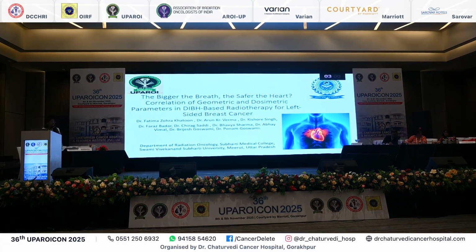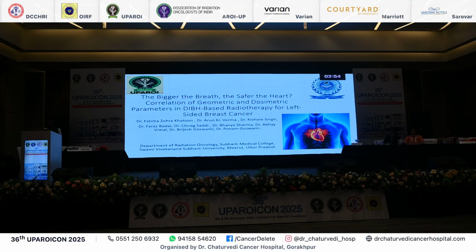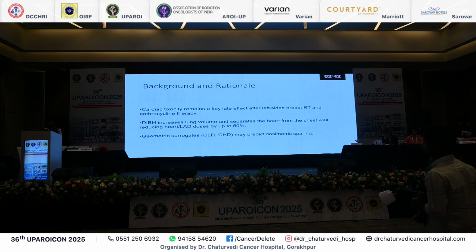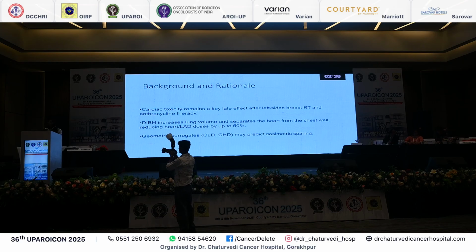Good afternoon, respected judges and colleagues present here. The topic we'll be discussing today is "The bigger the breath, the safer the heart": a correlation of geometric and dosimetric parameters in DIBH-based radiotherapy for left-sided breast cancer. The background and rationale for my study: cardiac toxicity remains a key late effect after left-sided breast radiotherapy and anthracycline therapy. DIBH increases lung volume and separates the heart from the chest wall, reducing heart or LAD doses by up to 50%.